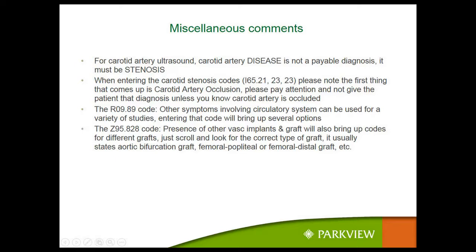No. I think it certainly opens your eyes to the number of things that you have to watch out for. Oh, yeah. Ordering for vascular and scheduling for vascular is very complex. And doing vascular is very complex. You know, when they have an echo, the echo tech is in there 20, 30 minutes, I think. When you're doing a vascular ultrasound, it's not unusual, especially if they're having, let's say, a carotid and a leg, that patient is on our bed and we are hands-on for 2 hours.